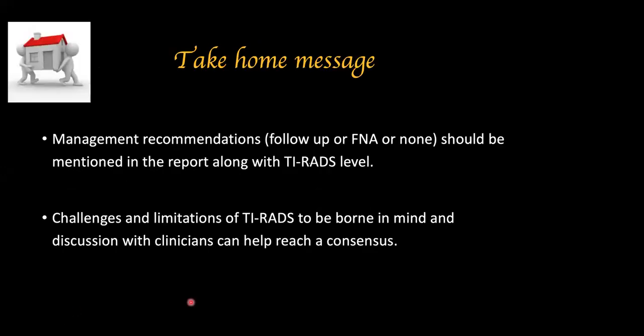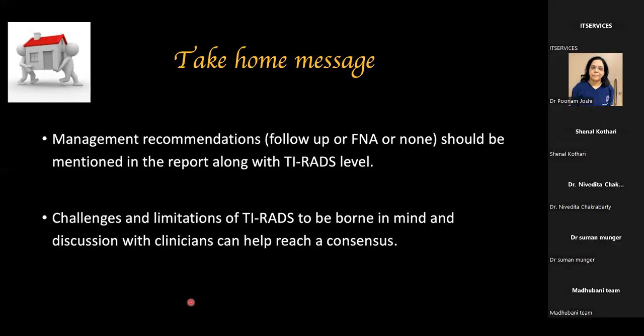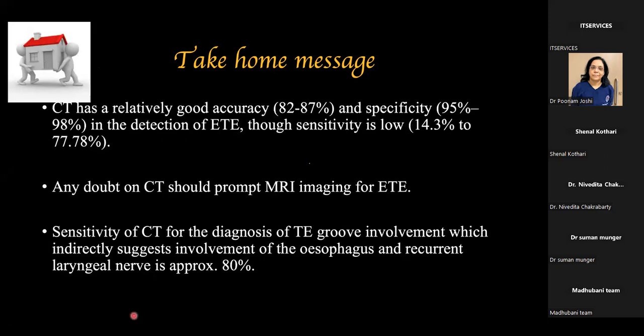What is the take-home message? The management recommendation, that is follow-up or FNA or none, should be mentioned in the report as per the ACR TIRADS level. There are challenges and limitations of TIRADS which should be borne in mind, and discussion with surgeons and clinicians can help to reach a consensus. Then CT has a relatively good accuracy and specificity in the detection of extrathyroid extension, though the sensitivity is low.